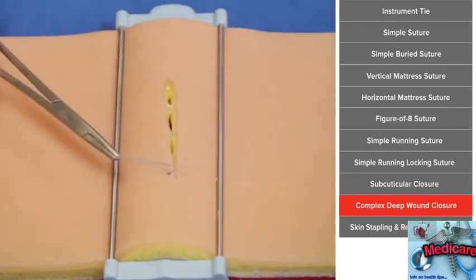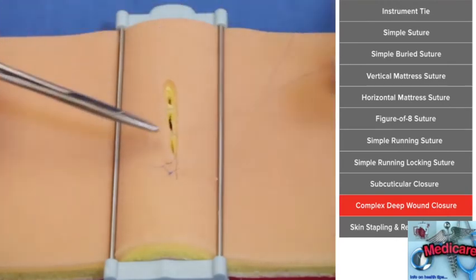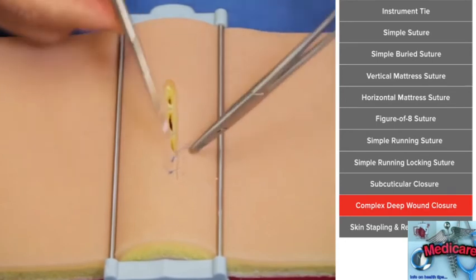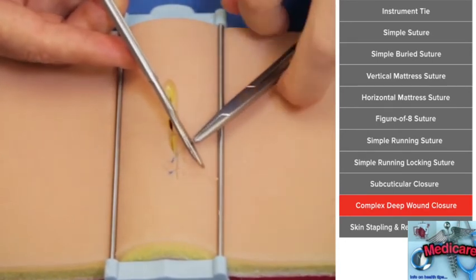If you don't place your sutures properly, the skin can turn in, and epidermis, the outer layer of skin touching epidermis, is not going to heal. So you'll take your stitches out and your wound will kind of break open, and you'll wonder why. It's because you didn't approximate your edges.